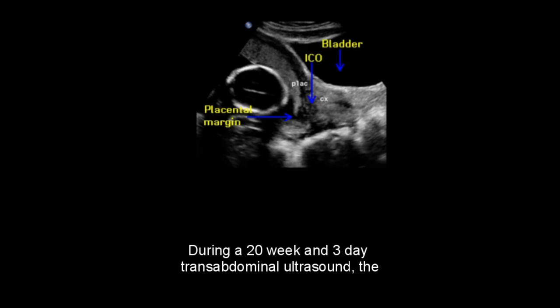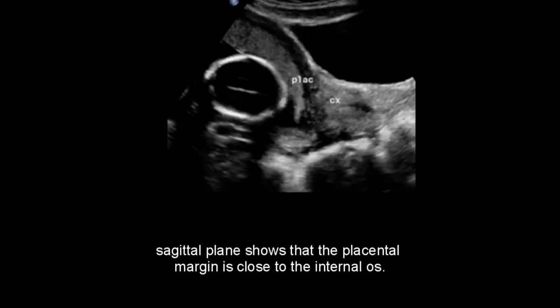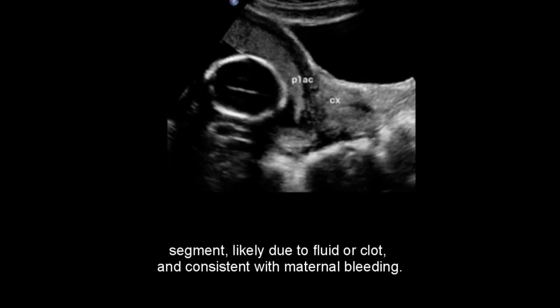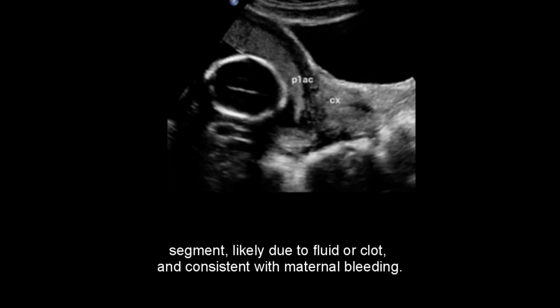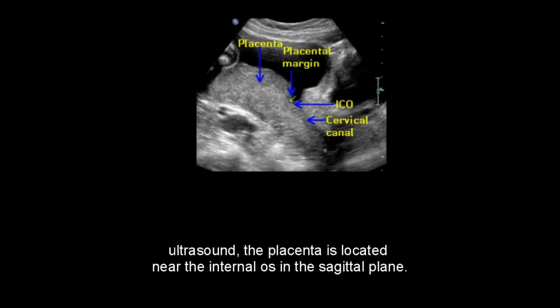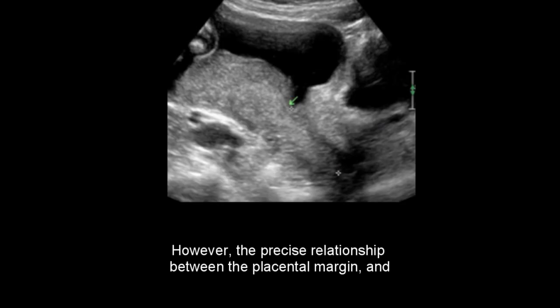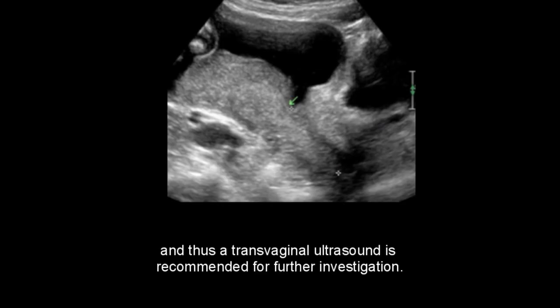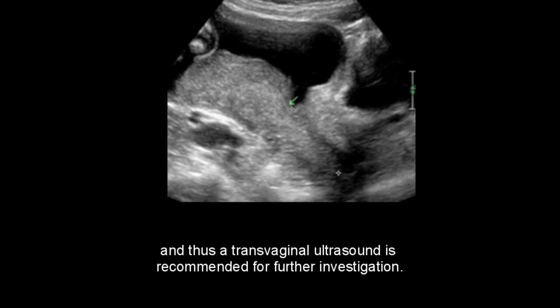During a 20-week and 3-day transabdominal ultrasound, the sagittal plane shows that the placental margin is close to the internal os. Additionally, there is a mixed echogenic pattern in the lower uterine segment, likely due to fluid or clot and consistent with maternal bleeding. During a 20-week and 5-day transabdominal ultrasound, the placenta is located near the internal os in the sagittal plane; however, the precise relationship between the placental margin and internal os remains unknown, and thus a transvaginal ultrasound is recommended.